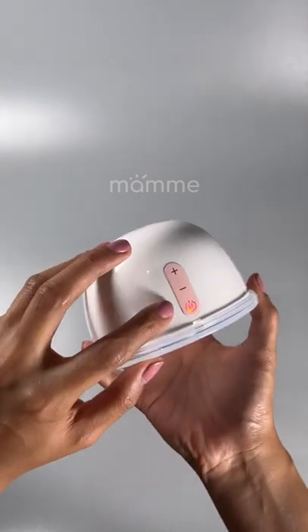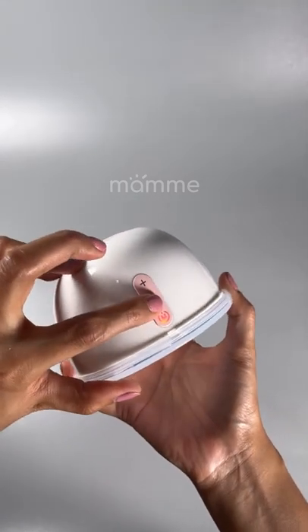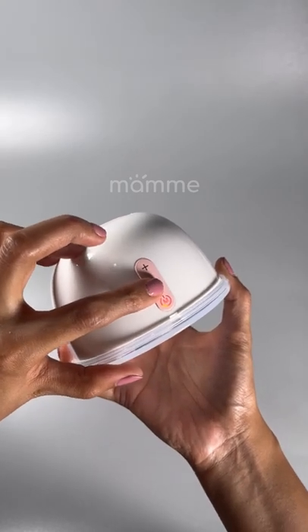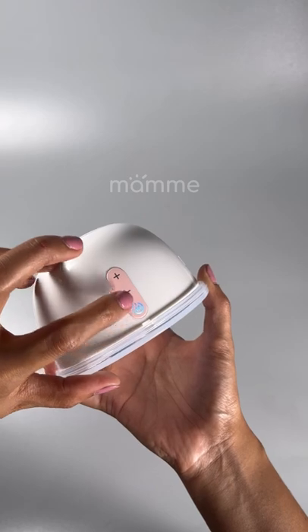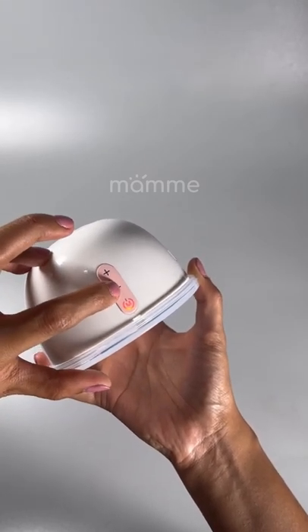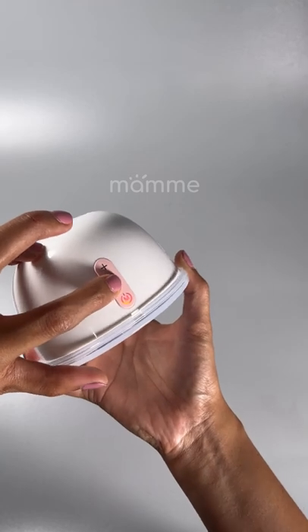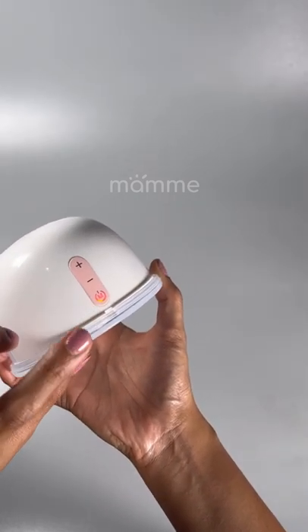Ayan. How do we decrease the suction? Just press the minus sign. Ayan. Same thing then. Paano mo malalaman if you are in the lowest level na? Ay, sorry. Napindot ko. Balik natin ah. Just press until mag-blink ulit siya. Ayan. So, we are now in the lowest level of massage mode.